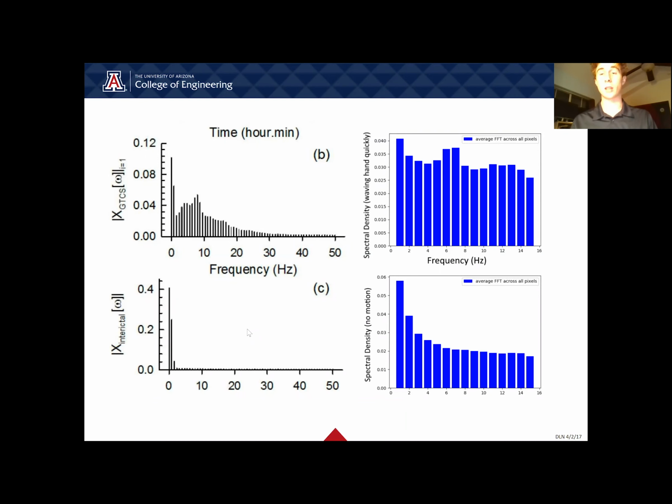Our analysis suggested that when we expanded this 1 point in space of the accelerometer to many thousands of points with the depth camera, the same principles would hold. And when we tried with the demonstration, we confirmed this result. So here on the right are plots that we made using the depth camera. So you can see that the shapes are really similar.